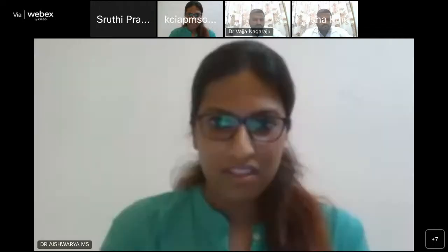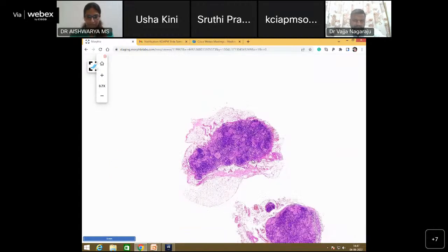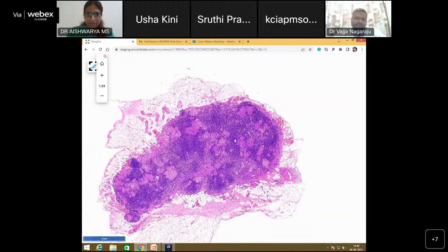Yes, ma'am. As Aishwarya rightly said, there are 3 lymph nodes, 1, 2, and 3. To begin with, you said the architecture is effaced. Can you comment on what you mean by the word effaced?